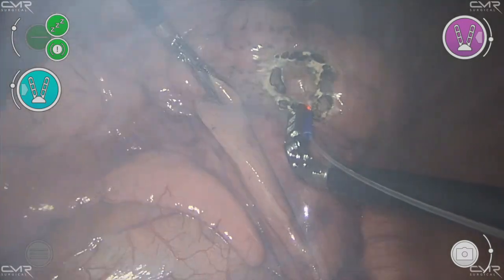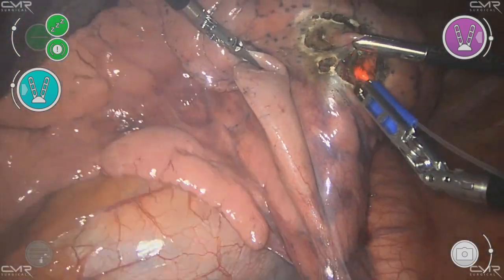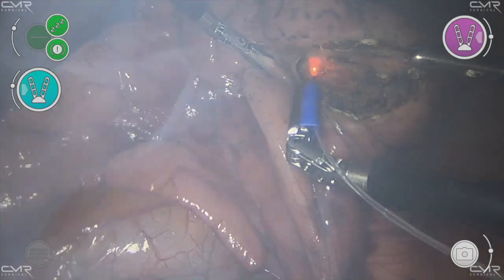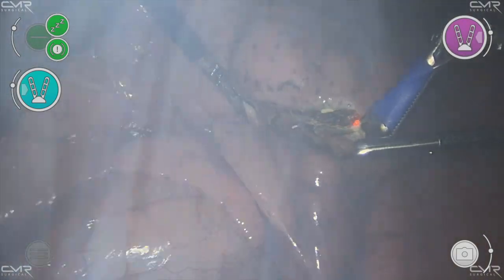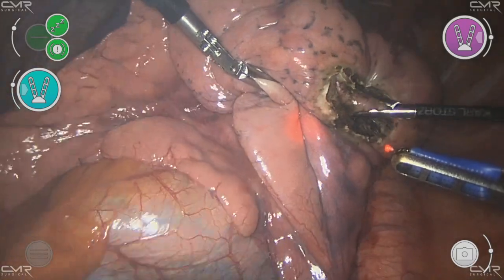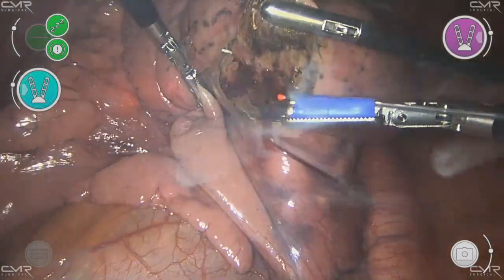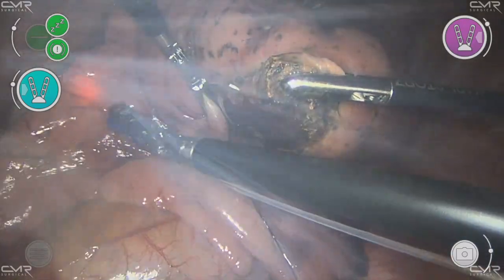There were multiple nodules on the CT scan so the mission was just to go and remove several of the easy to find nodules to confirm histologically what the diagnosis is. Sven has really rather cleverly designed this to combine the CMR surgical system with his laser. As you can see he simply taped the laser to one arm of the bipolar, and a really nice feature not particularly shown in this part of the video is that he was actually able to use both arms as a grasper - by simply opening and closing his right grasper he can still use it to manipulate the lung. This was purely for histology and not for R0 resection, although it is entirely possible to resect with an R0 resection margin, especially for multiple tumours - it is especially useful because you are reducing the amount of parenchymal loss with a deep wedge resection.